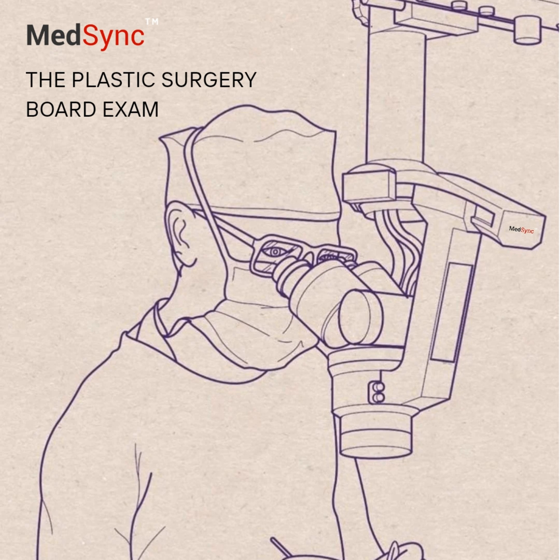What's the typical technique? Place a non-adherent layer over the graft, then the sponge, seal it, and apply continuous pressure, usually -75 to -125 mmHg for about 4 to 7 days. And the evidence supports this. Yes, good evidence. Better wound bed prep, less graft loss, level I for split thickness grafts, shorter hospital stays, maybe even better cosmetic appearance, and improved take on chronic leg ulcers. Also beneficial for incorporating synthetic dermal matrices.